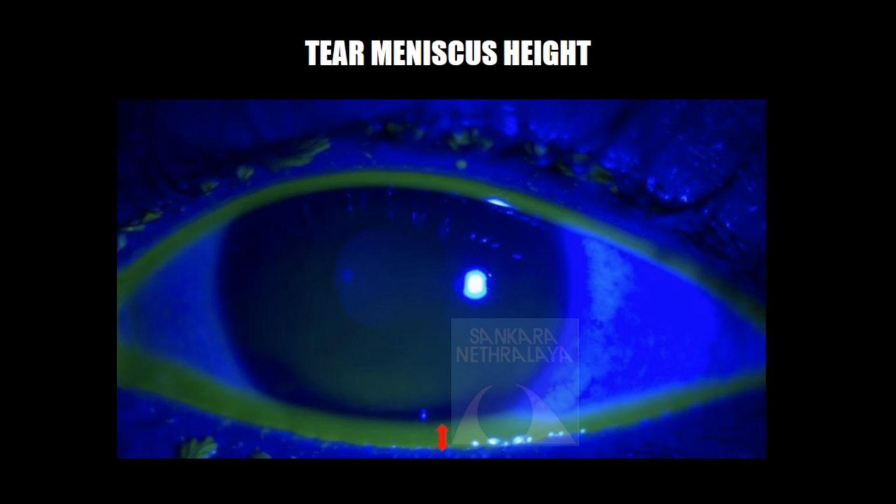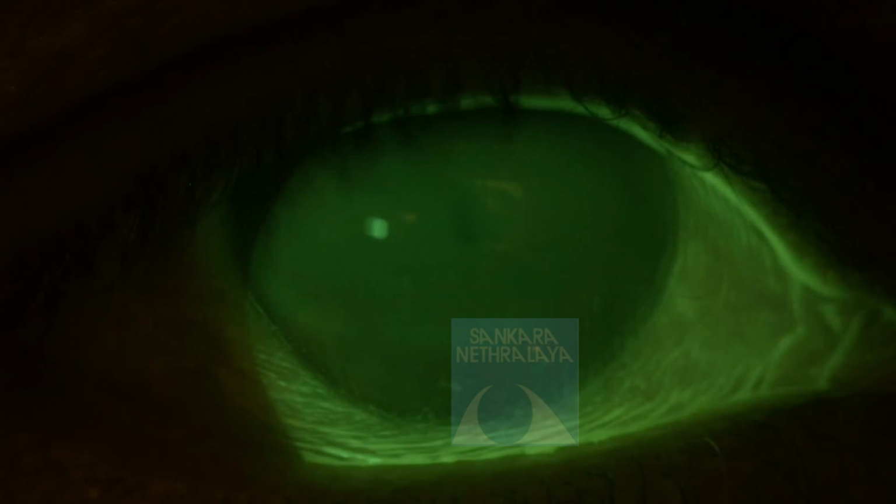Dry eye evaluation involves both functional and structural assessment of the tear film and the ocular surface. Fluorescein dye helps visualize the tear meniscus along the lower lid margin. It's a crude method to assess the volume of aqueous in the tear film. In a normal eye, it's around 0.2 to 0.4 mm, while in a dry eye, it's less than 0.25 mm.